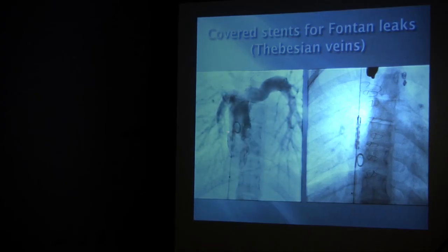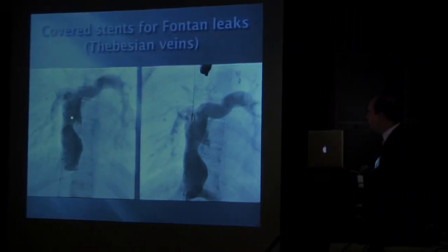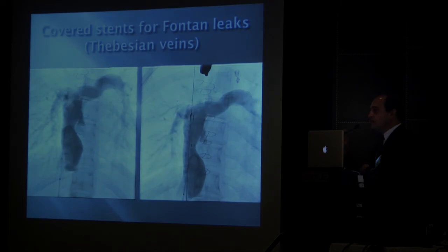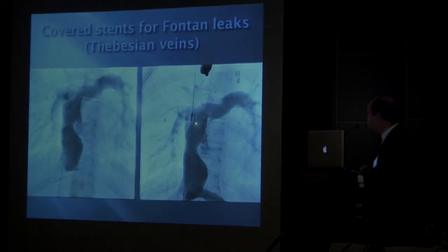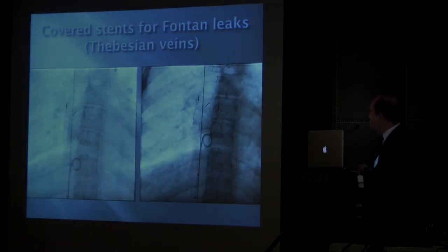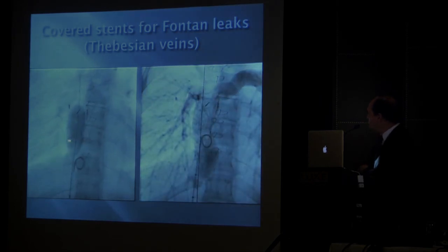This is a patient who had a Fontan with low saturations, found to have a whole network of little venous connections from the Fontan to the atrium. This is the Gore aortic extender — a self-expanding stent covered with PTFE — being positioned at the site of those venous connections, with a slight narrowing we also hoped to relieve. After the stent is released by pulling a rip cord, it achieves full expansion, is post-dilated, and the picture afterwards shows the result.